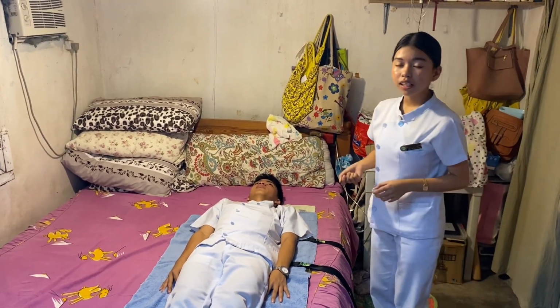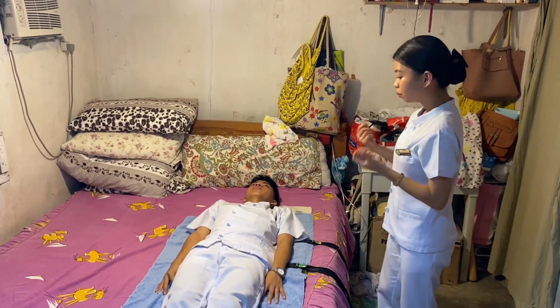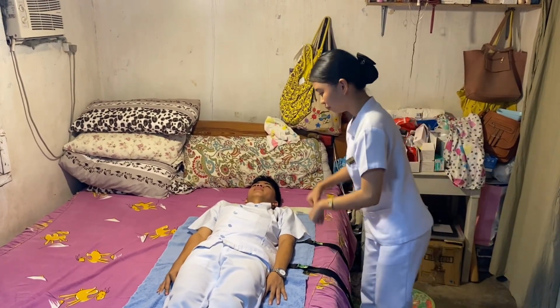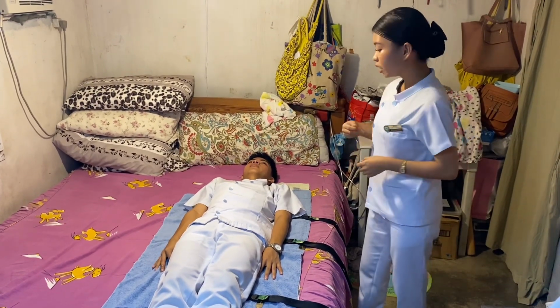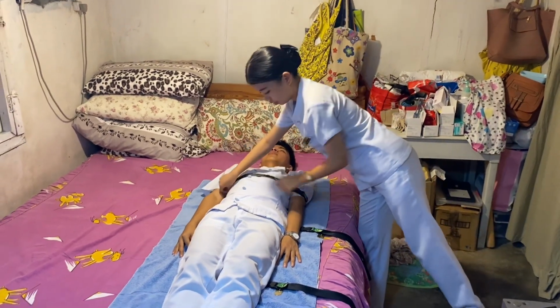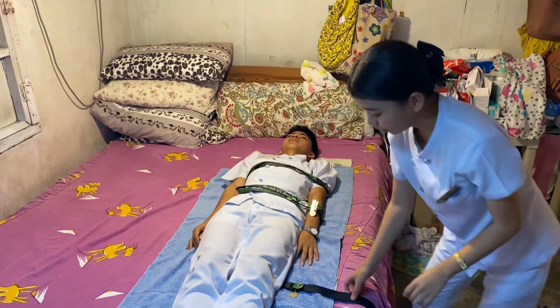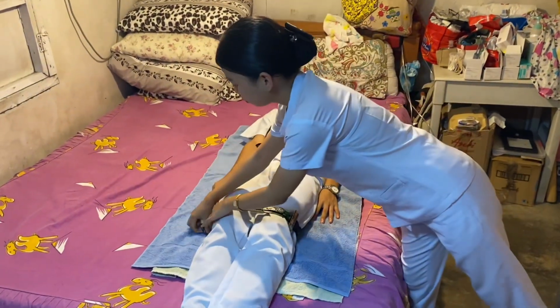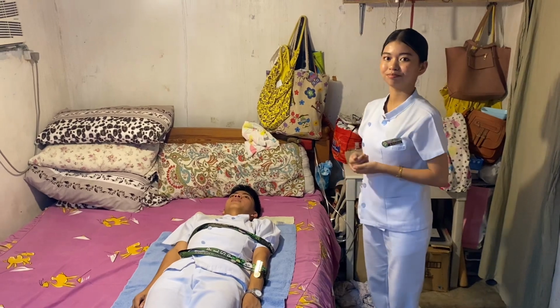Now immediately raise the side rails of the stretcher for the patient's safety. Also, we're going to fasten the safety straps across the chest of the patient, across the abdomen, and across the legs. Now the client is ready for transferring.